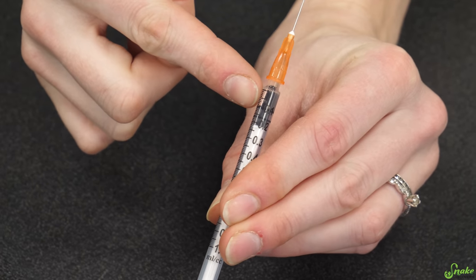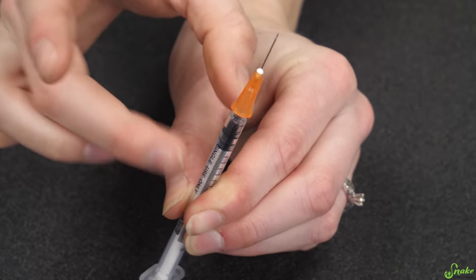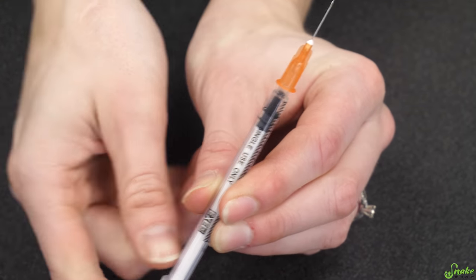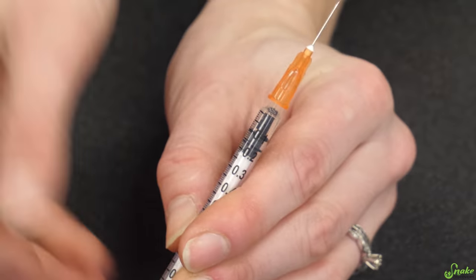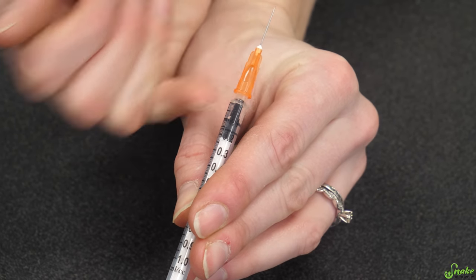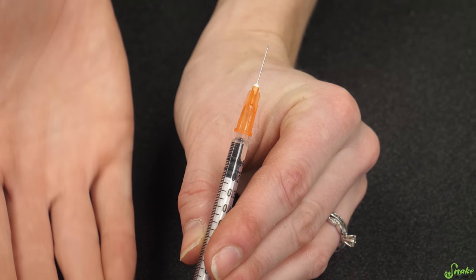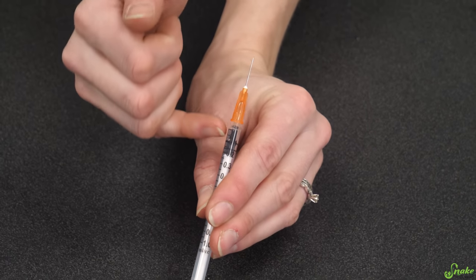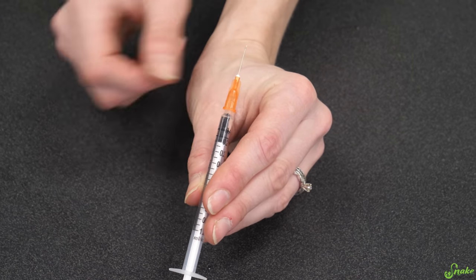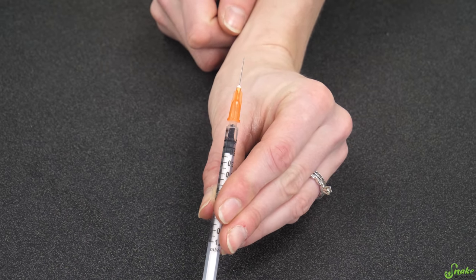If you notice there are small bubbles in your dose, you can try to flick them out with the needle pointed up, and when all the bubbles have accumulated near the front, you can push the plunger in to push those out. But that might change your dosage, so make sure you still have the right amount afterwards. Typically, small bubbles aren't a huge deal unless they're big enough to distort your measurement. So you can just leave them as is, as long as there's not too many or too large of bubbles.